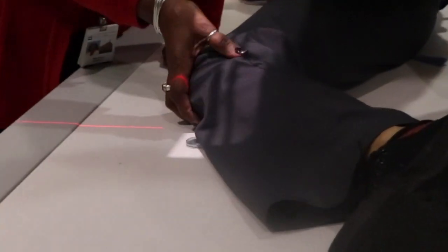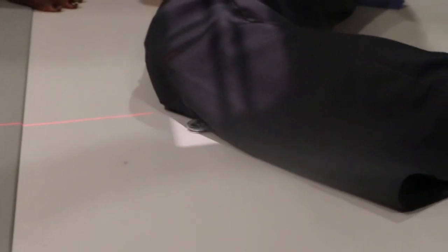Ask the patient to hold still. If they can't, you can put a positioning device under their heel. Make sure that line is still straight. I'm going to ask the patient to hold still, don't move. We have a 40-inch SID. We have a 7 degree cephalad tube angle, and we're centered a half-inch distal to the medial epicondyle. 10 by 12, portrait fashion.